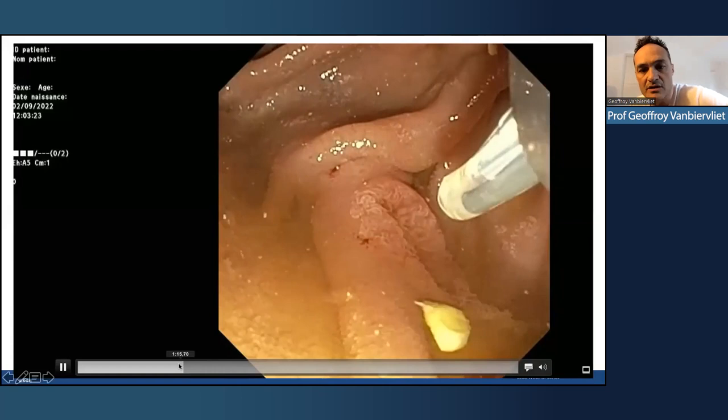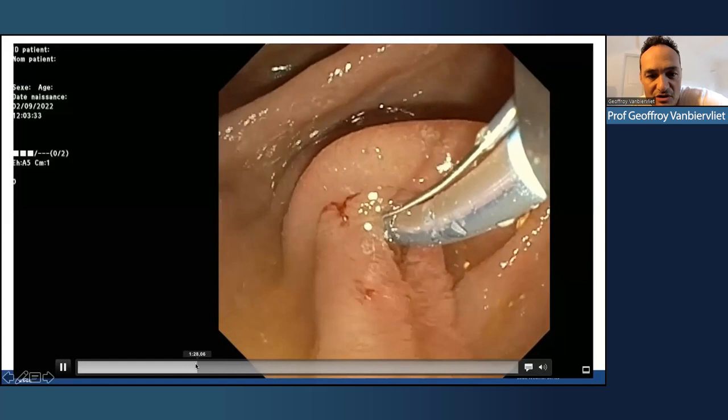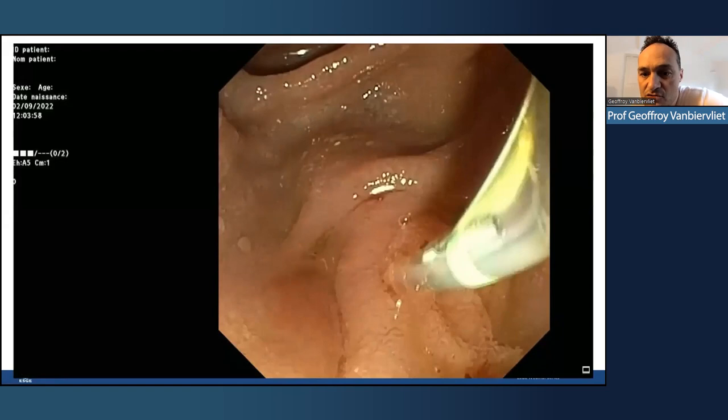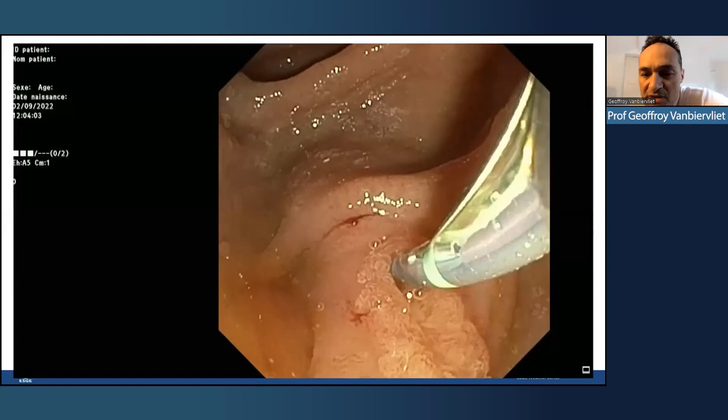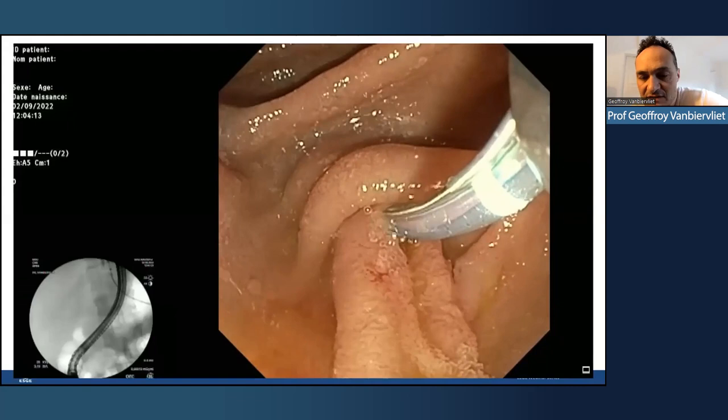You try to search, you wait for the famous number of 5 attempts before changing the technique you want to use. And I just sped up a lot to show you that after that, the second step is to perform a little opacification, try to have a duct opacification. And if it is not possible, you will change your technique for an alternative technique. It could be the free-hand technique or the fistulotomy.